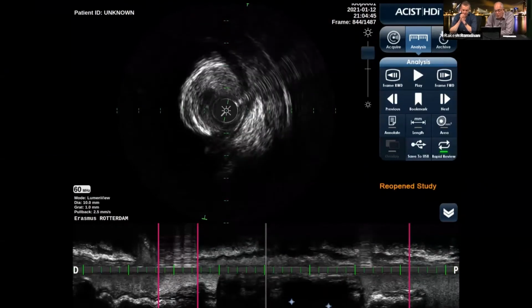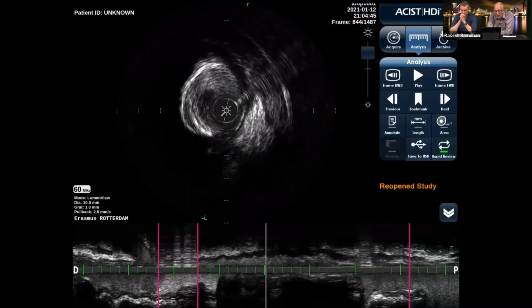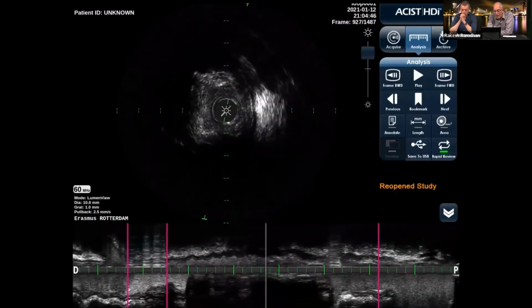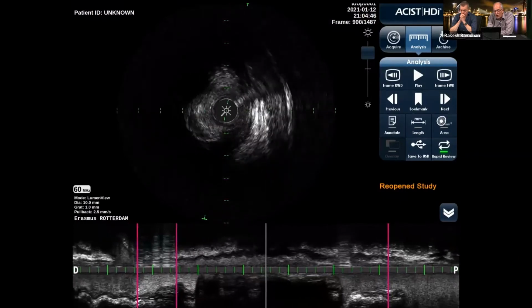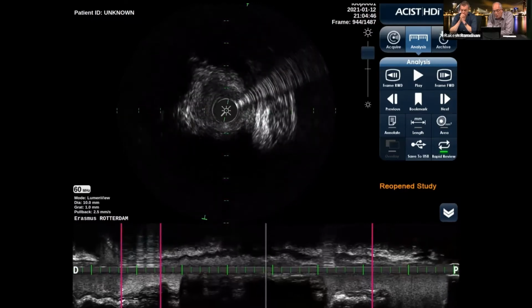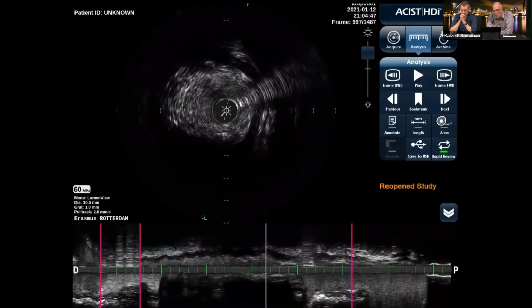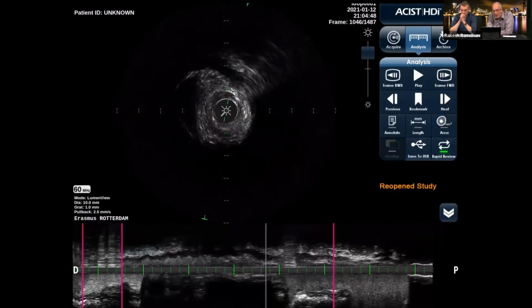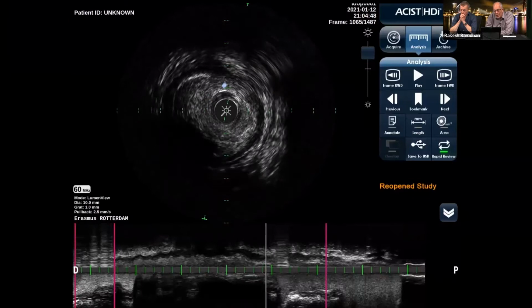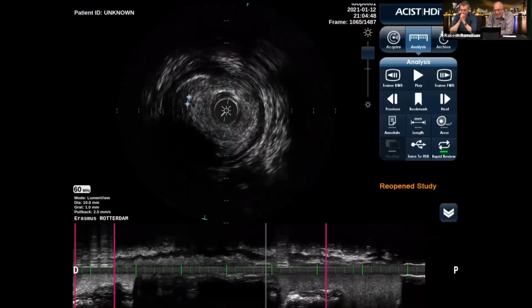So we can see here the thrombus, still non-moving blood, and that means if we go more proximal, then we see here also the subacute thrombus and the spot where the IVUS catheter is occluding the vessel. And we see that there's more thrombus here, and here it's a whole region of subacute thrombus. I indicated it in here, you can recognize it. It's brighter and darker in there, more homogeneous than platelet aggregation.